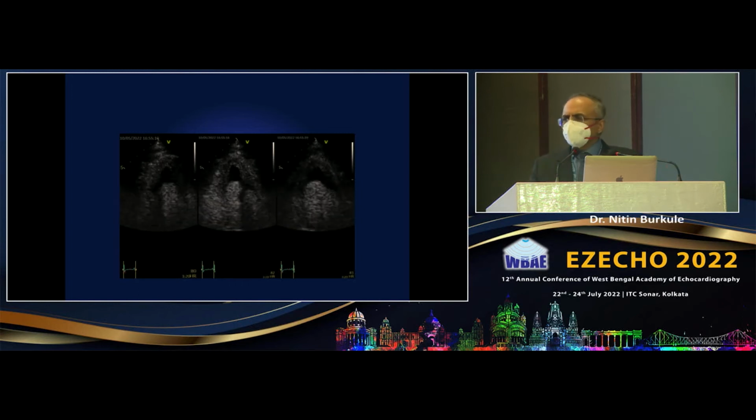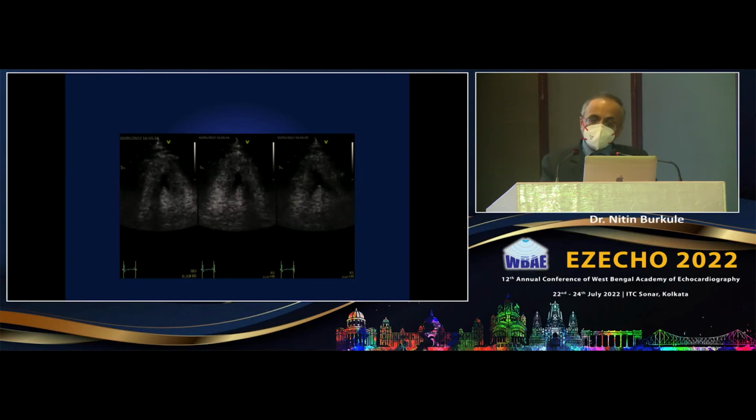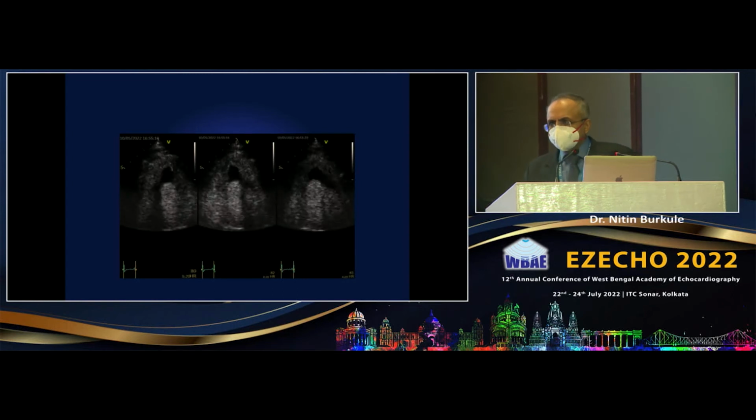But what more can the MRI show me? Beyond this, there is something it can show which can be very interesting academically, and also will have some therapeutic potential. Because I don't know if this filling defect is active or is fibrosis, like an advanced EMF by now.